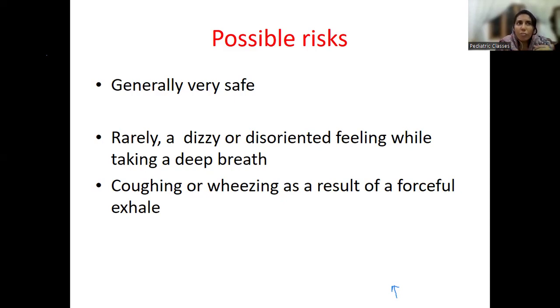What I found in my practice is that sometimes kids tend not to purse their lips properly around the mouthpiece. That is one thing I felt. So you have to tell them properly, purse your lips. Another thing is that when you're taking a deep inhalation and then putting it into the mouth and then giving the exhalation, they may take a little bit of time.